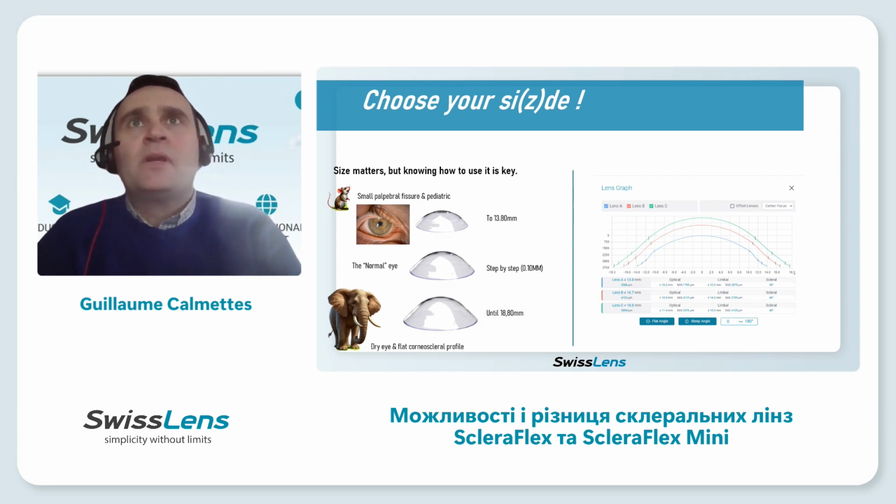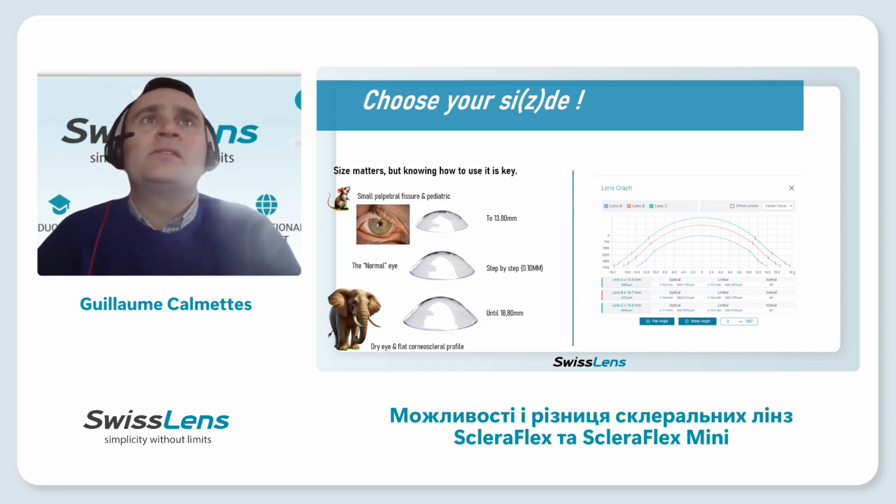Scleral profile. You see, on the left of my screen, there are some diameters we can choose in Swissland. I will show you a little bit later. We can choose in steps of 0.1 millimeter between 13.8 and up to 18.8. So a large range of scleral.